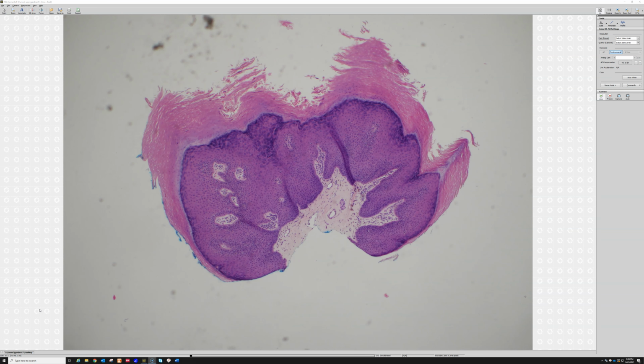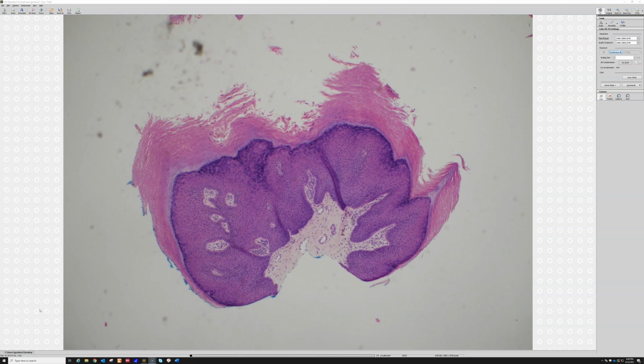So this one, the papillae are much more blunted and rounded, okay? See how they're a little bit rounded? Now, whenever I see rounded papillae, I do think about genital warts, condylomas. So if this is on the forehead or something, well, probably not a condyloma. I mean, I guess anything's possible. But in any case, if I see something with features of a wart but rounded, knuckle-shaped protrusions instead of finger-shaped protrusions, and it's in an anogenital site, then much more likely we're dealing with a condyloma. And I'll do another full video about condyloma at some point because there's some different things you have to consider and handle in that situation.